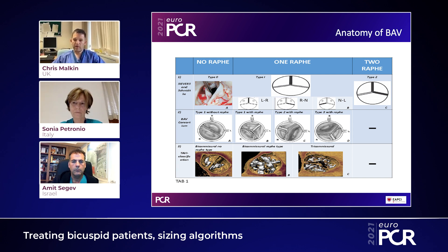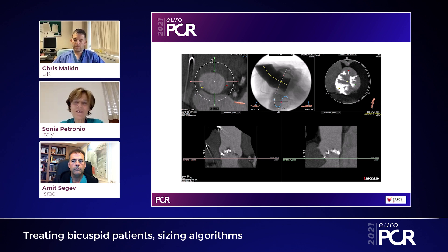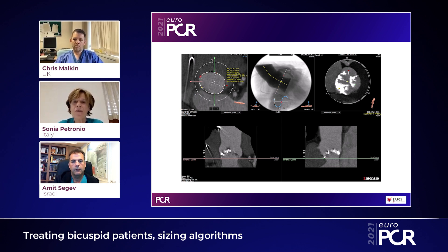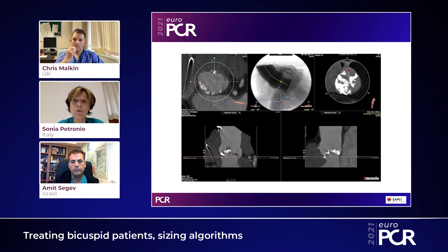I'll hand over to Sonia to go through in detail the sizing algorithm for one of her recent patients. Sizing on bicuspid is a very intriguing subject, and it is very important to understand exactly what you are going to see if you scroll up and down a CT like this one. This is an example of a patient where you can see the amount of calcium, which is very typical of bicuspid, and the calcium distribution is also very important.